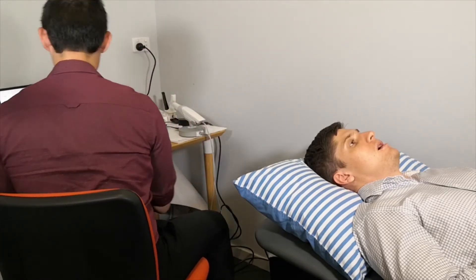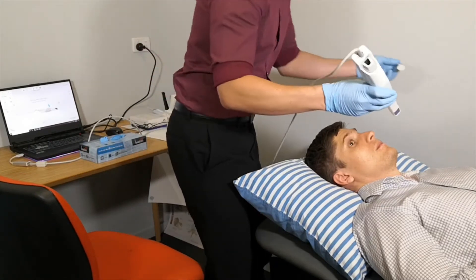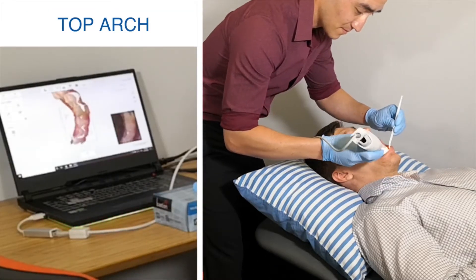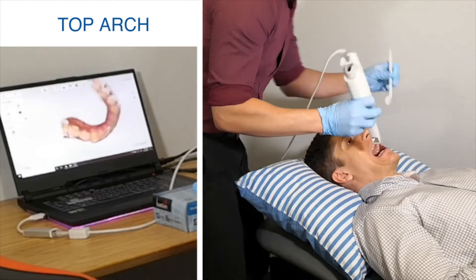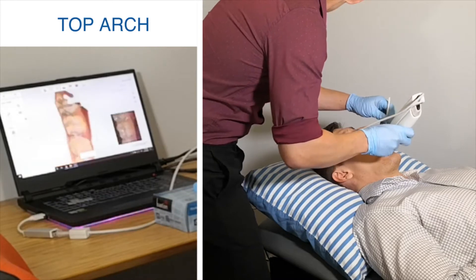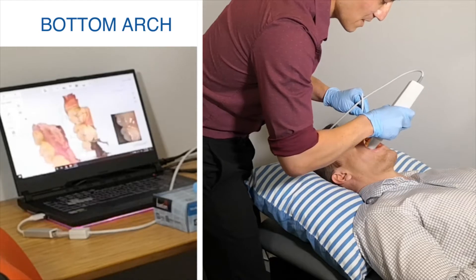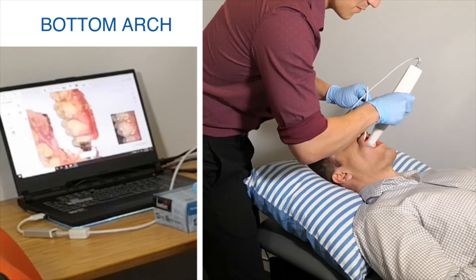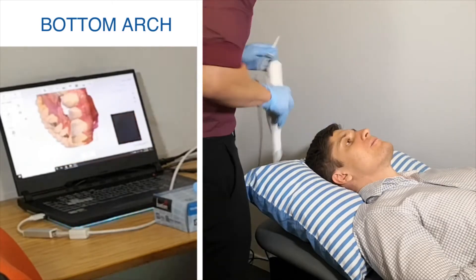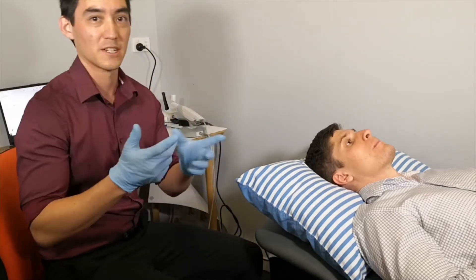I'm just going to grab a mirror. It's good to have the patient just close a little bit when you're taking the upper arch buccal of the molars, as it releases the soft tissues and makes it a bit more comfortable for them. So those are the two upper arch full arch scans done.